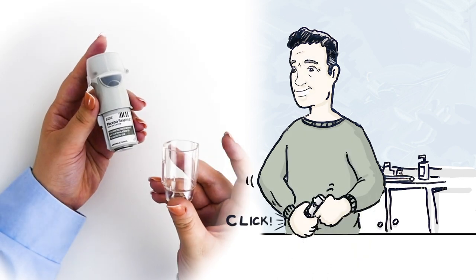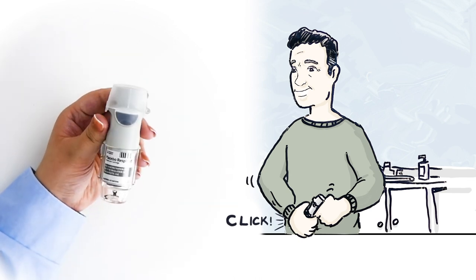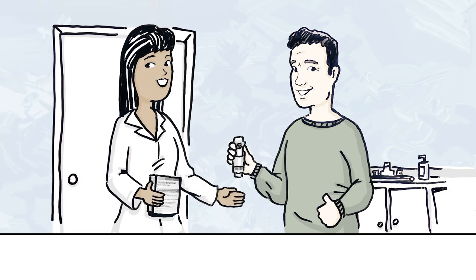He then replaces the clear base by aligning the notch with the safety catch button and slides them together until they click. Now, the inhaler is ready for priming.